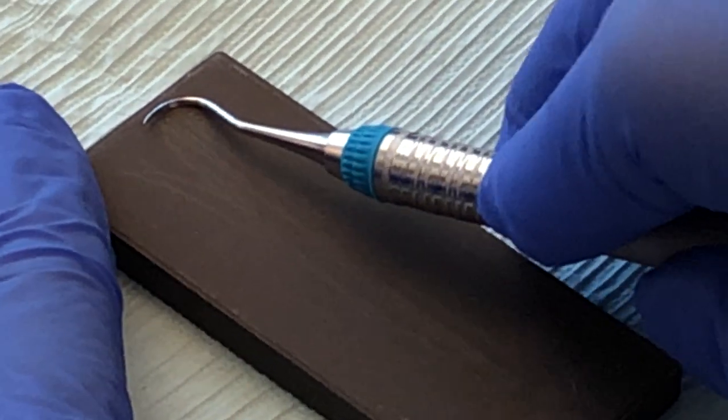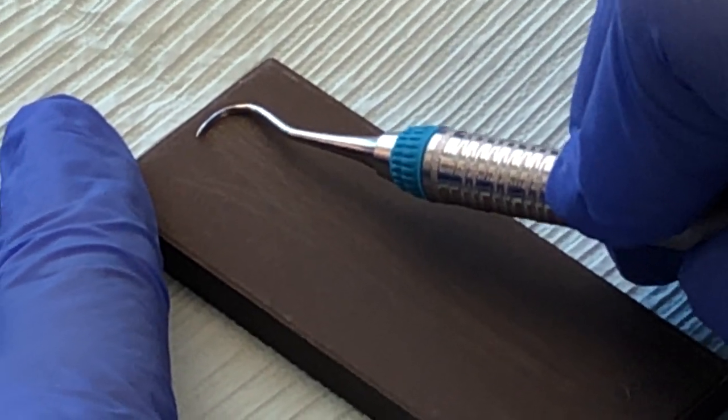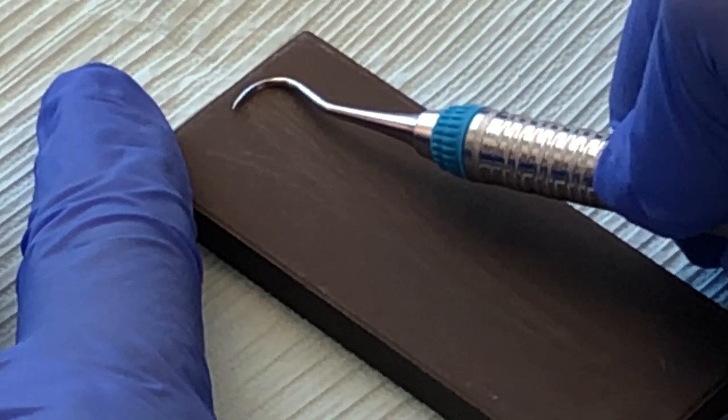All right, sharpening the sickle. Orient it at the far end of the stone. Find that spot where the cutting edge grabs the grit on the stone. It should be 70 to 80 degrees.